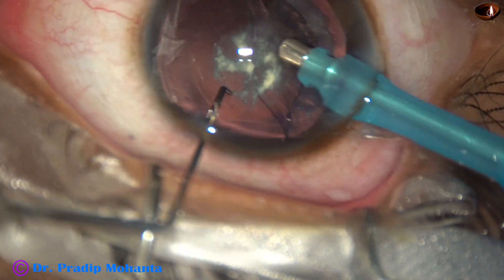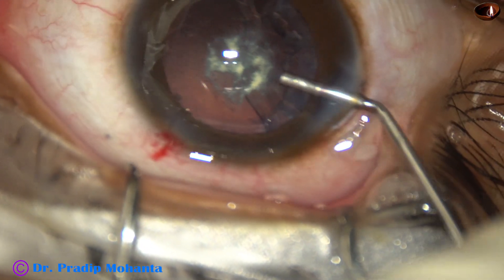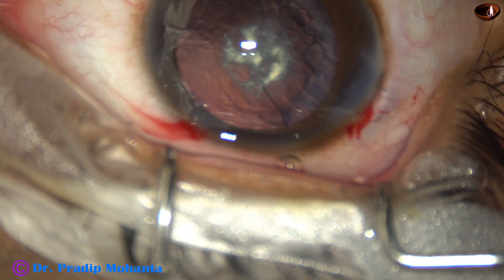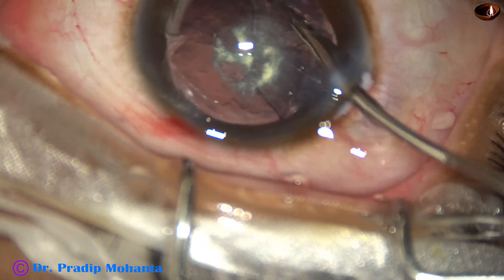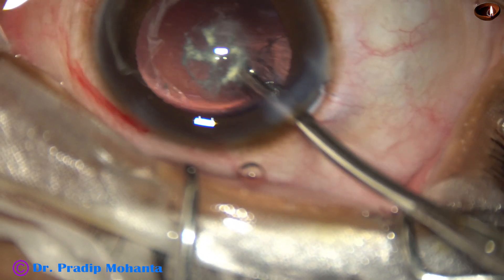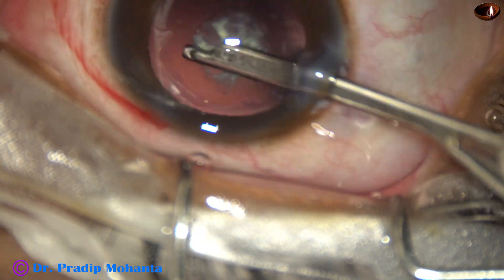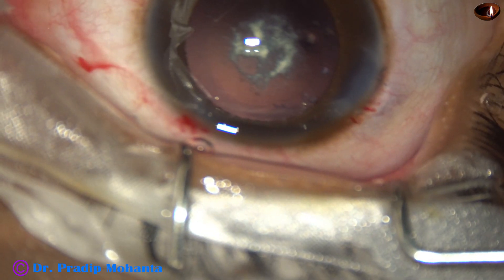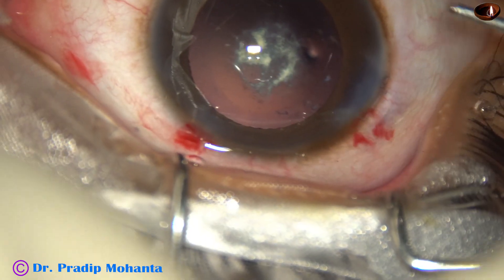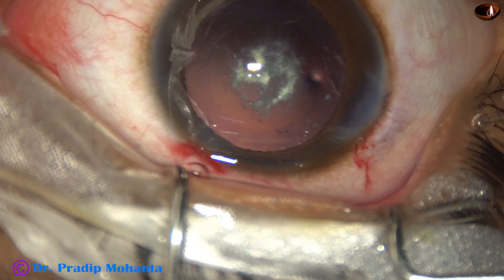There is some soft cortex from 12 o'clock to 6 o'clock. Injected viscoelastic. Using this 23-gauge Simcoe cannula to remove the cortex. And now you can see there is a white plaque right at the center of the posterior capsule. If it remains like this, the patient will not get any vision. Though there is a chance the patient may have developed form deprivation amblyopia by this time.